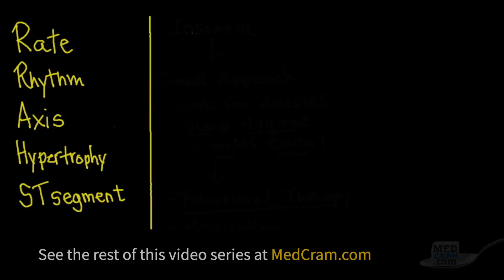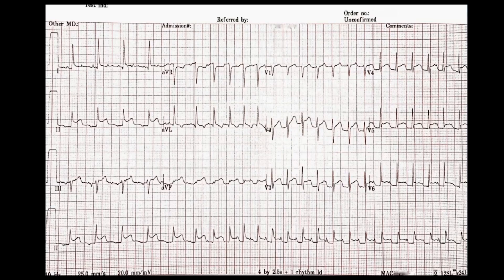Let's first look at the rate on this EKG. At the bottom we can see the criteria for what is set. The speed of the EKG is at 25 millimeters per second, which is pretty standard. What's not standard is the 20 millimeters per millivolt, and you can see that the standardization box is about twice as high as it would normally be. So just keep that in mind.